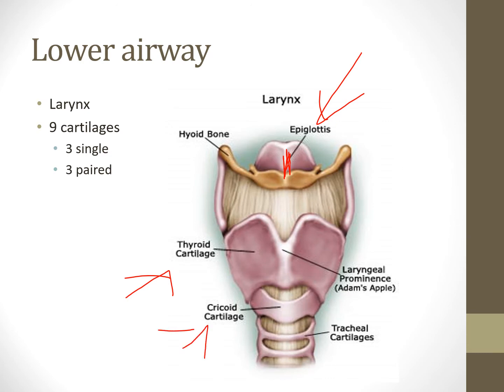When we talk about cric pressure and all that, that's where we look at putting pressure on the cricoid cartilage, and you might see that. Some people might want it, some people might not. During intubation, if someone has a very anterior airway, in other words, we can't see the vocal cords for some reason or another, you can ask for cric pressure. It's also called a Sellick maneuver, like Tom Selleck, right? It's called a Sellick maneuver.